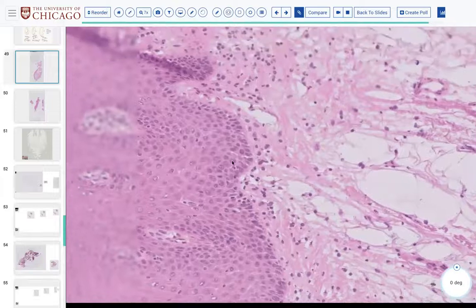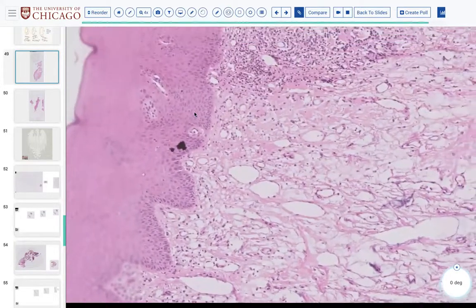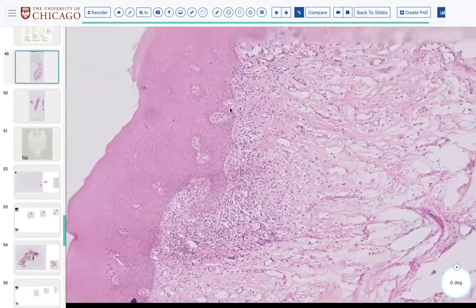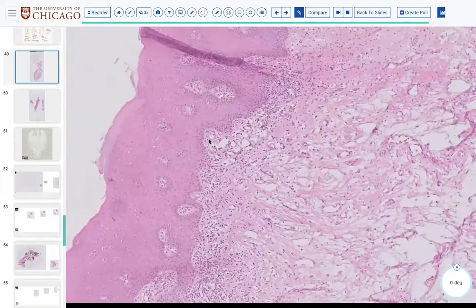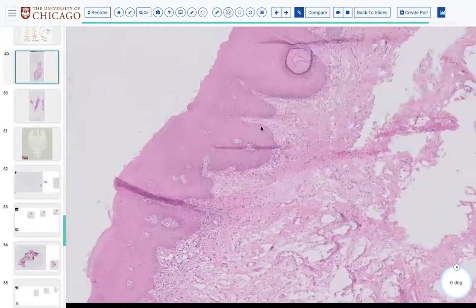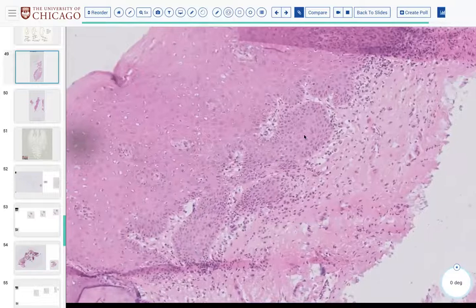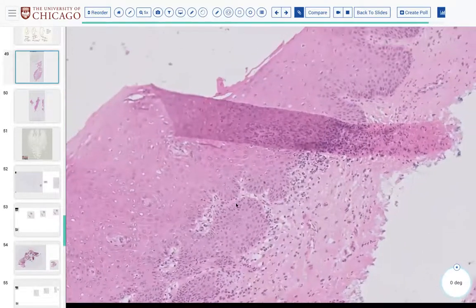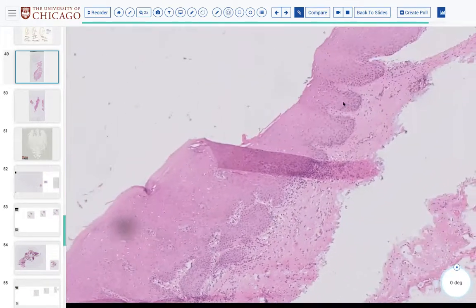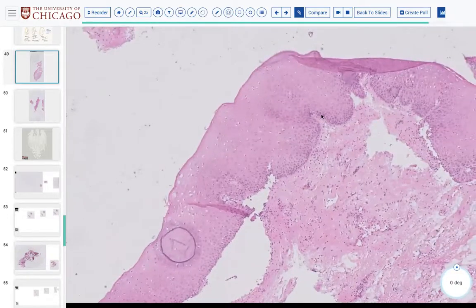There is no dysplasia. We have one vote for no dysplasia. I guess if you're concerned, you can always do deepers. Concerned for what? Well, if you're concerned about invasion. In this case, I think there is dysplasia, but it doesn't look so high grade. Maybe except for this area here, see if it all lines up. There's also a little chronic inflammation. I don't know if that colors our perception at all. Probably not enough to have an effect.